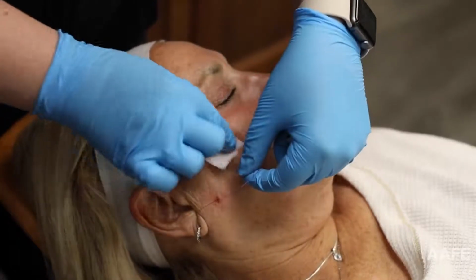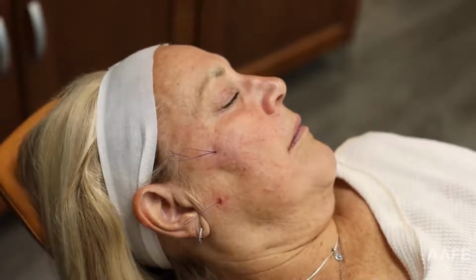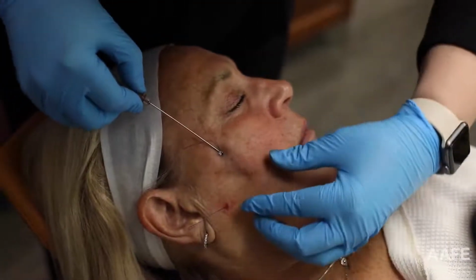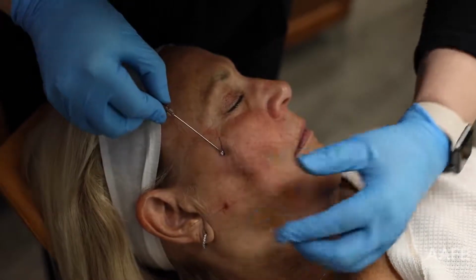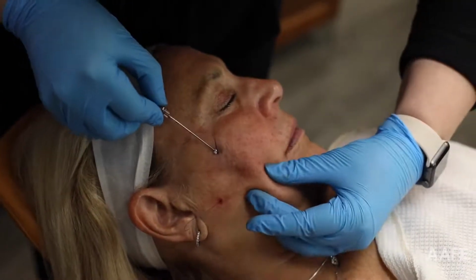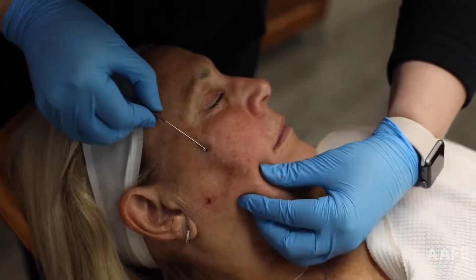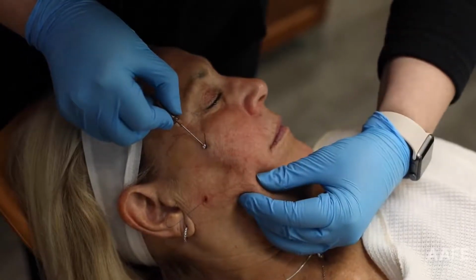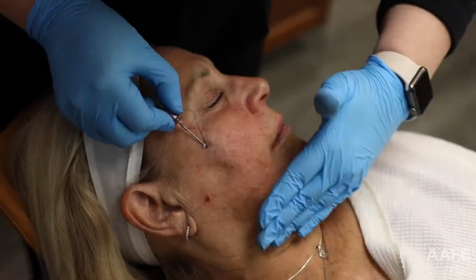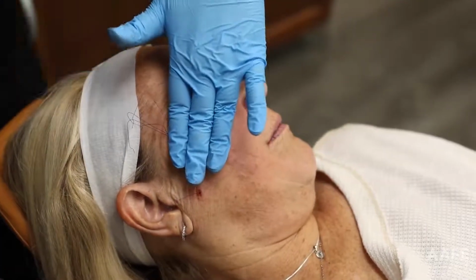So I'm just alcoholing the outside again just to make sure she's nice and clean. And we're following the same vector we've already done, so she's already numb in that area. Don't need to add any more lidocaine. A little further, and you can see I'm all the way down here. So gentle pressure up, and that's it.